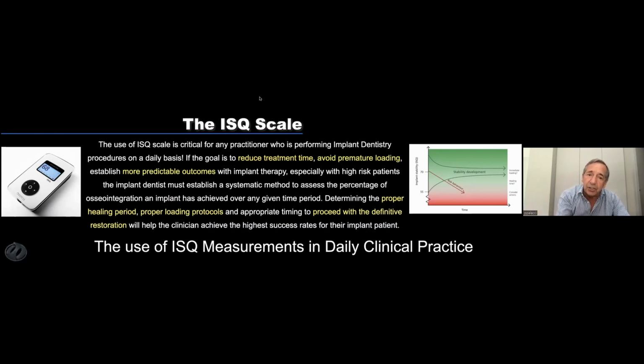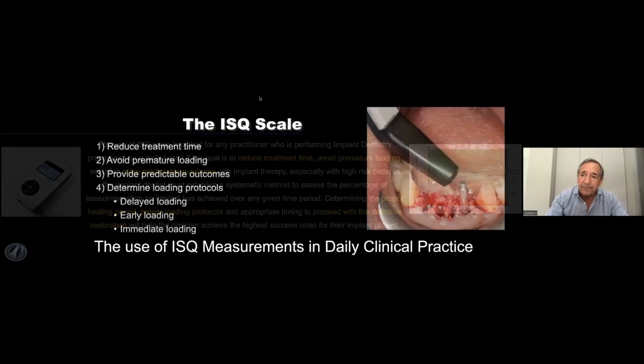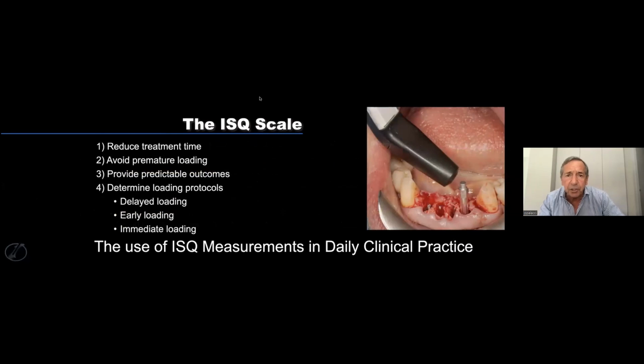the ISQ is too low, you may lose the implant, lose the bridge, and the patient who was supposed to have the tooth in 1 day will end up having the tooth in 1 year, because you need to regraft, wait with a removable, wait for integration, and then this is a dramatic change. So this ISQ scale will help us to reduce the treatment time, avoid premature loading, provide predictable outcome, determine loading protocol, such as delayed, early, or immediate loading.